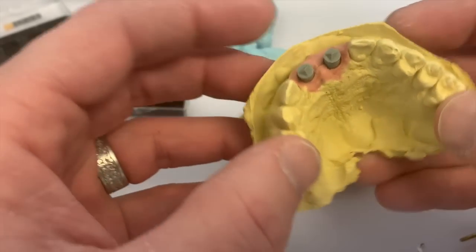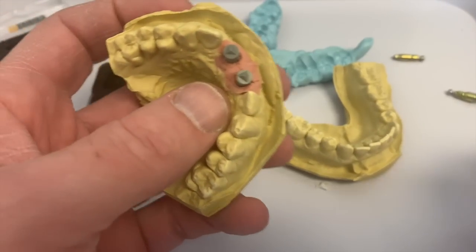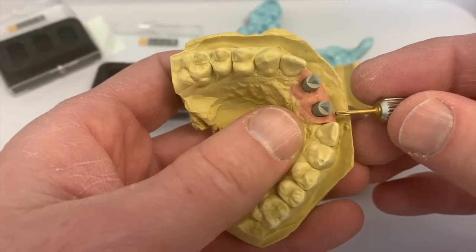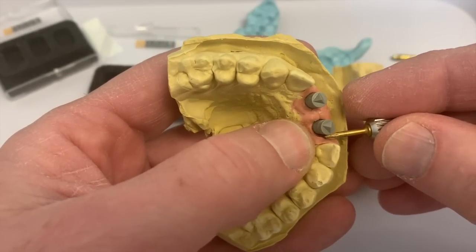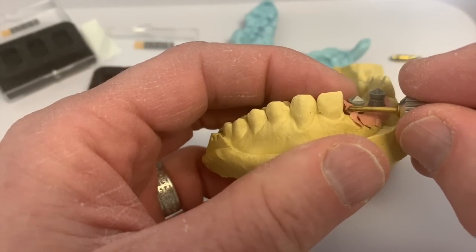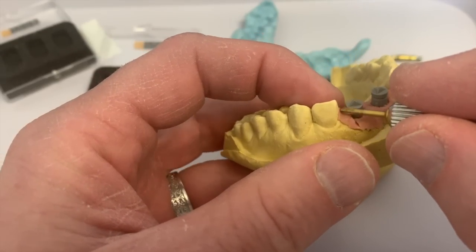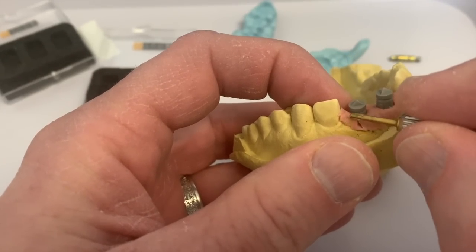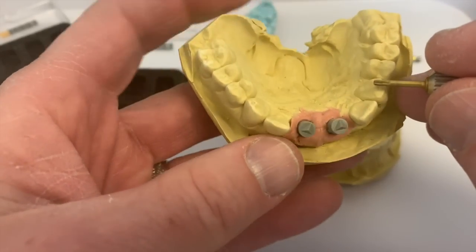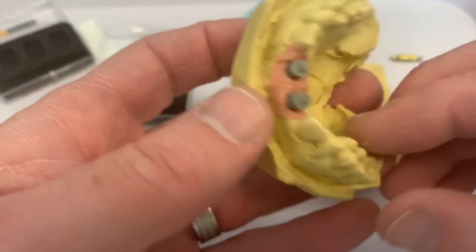So at this point, we're going to go ahead and scan. And I do want to make sure when I do the scanning with the Omnicam that this tissue is in the right place. So probably what I'll do, since it's a little deformed up here, is I'll trim off some of the underside to make sure it seats all the way, because I don't want a misrepresentation of what his mouth actually looks like. So we're going to go ahead and scan it, and we're going to take 3 images.